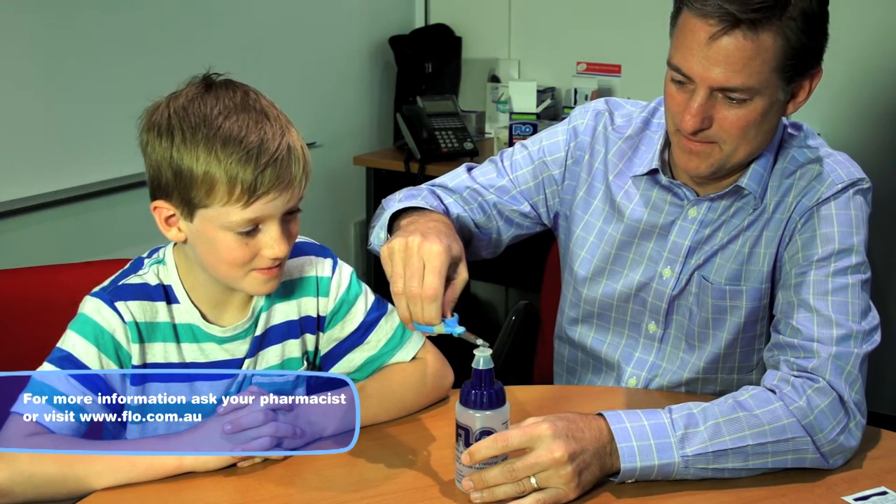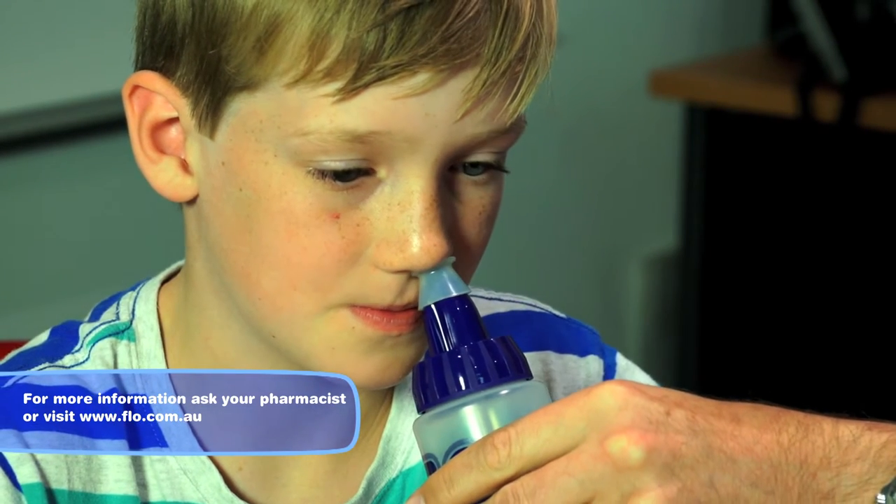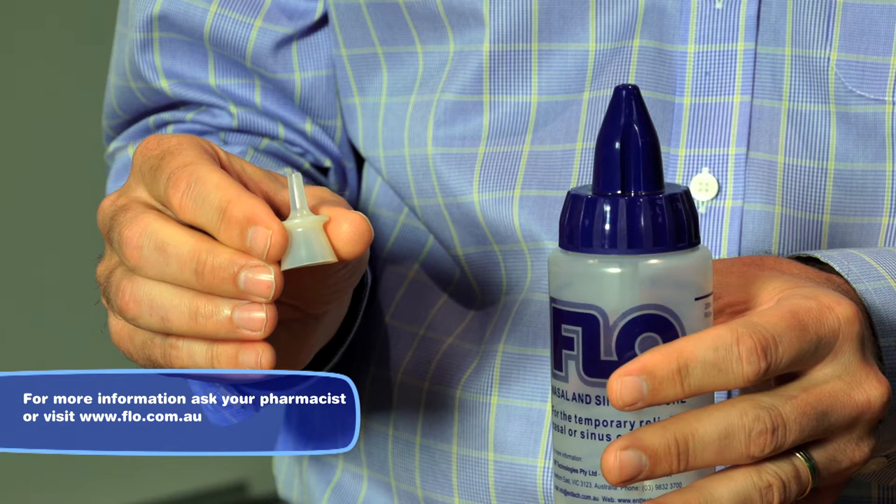This special adapter is useful for younger children but need not be used in older children whose nostrils can easily admit the tip of the blue cap. The silicon tips can be obtained by requesting them from your specialist.